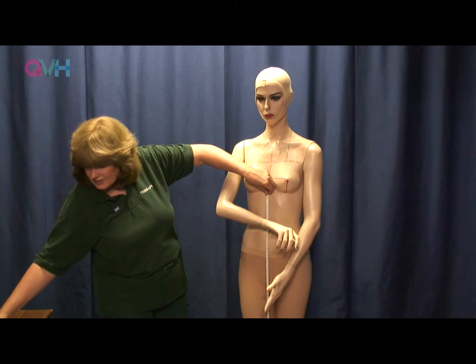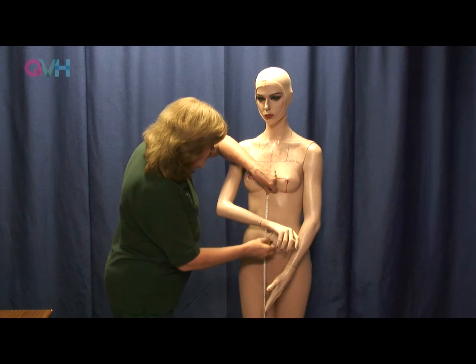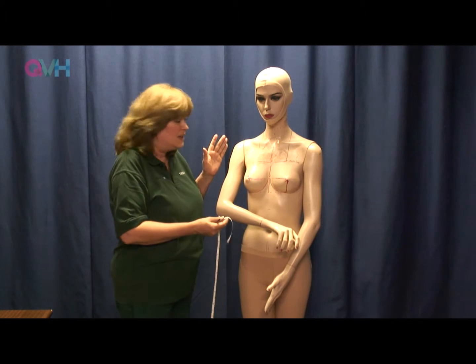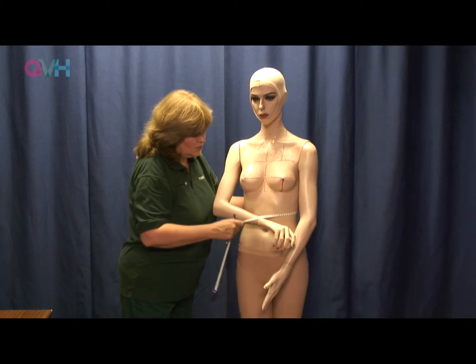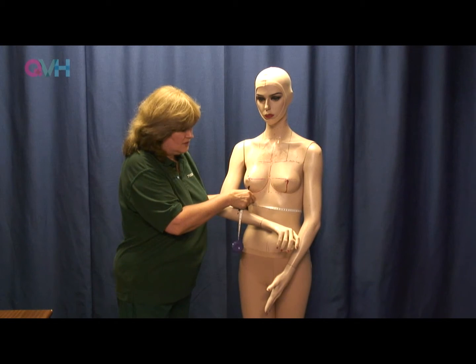And in this case, we have 2 divisions, and so I would halve that measurement, which at the moment is 16, and so I would decide it was 8. Now on a child it wouldn't be 16, it would probably be 10, and then you'd have 5 and 5. And then I would measure, as you imagine, without knocking the model over, on that measurement.